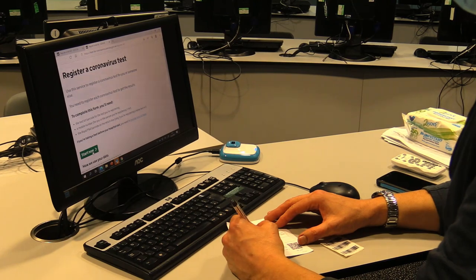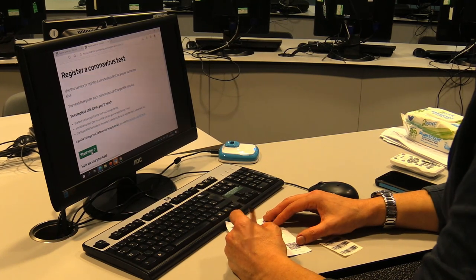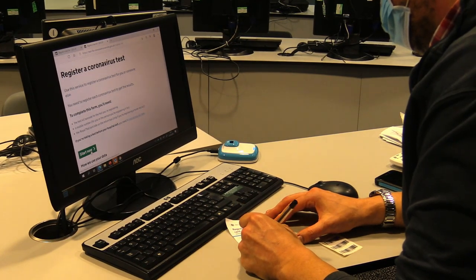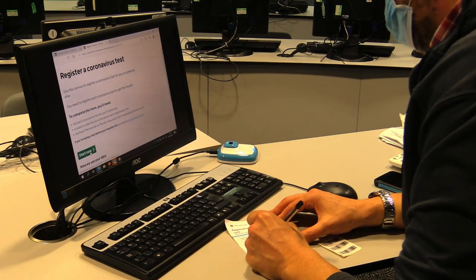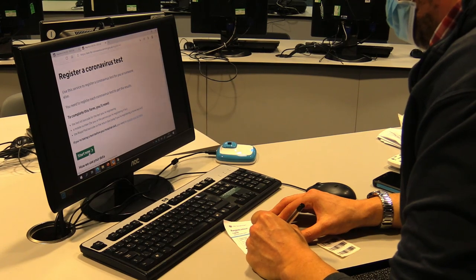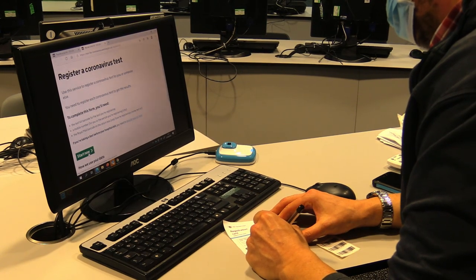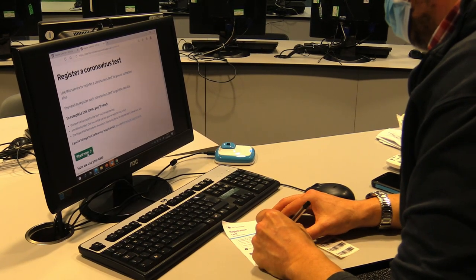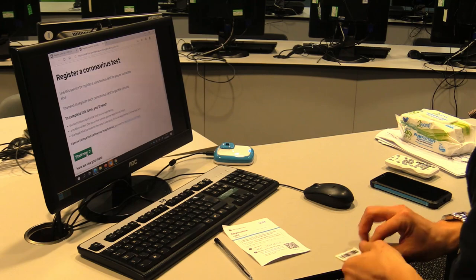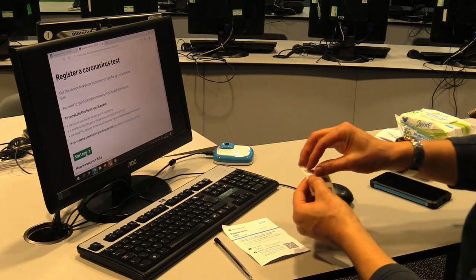So Miss, you want me to write my name clearly here? Yes please. And then you're going to want me to stick my barcode in the space provided? Yes, just one please.